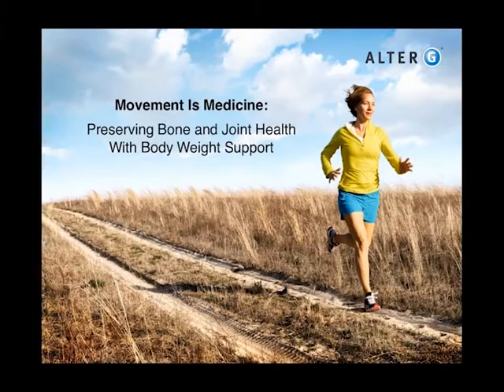And then I also focus more on the walking speed, maybe incline, before I change loading. So when someone's in the AlterG and I know that they're pain-free at 60% body weight, I will challenge them to try to take bigger steps. Again, because if they're getting better hip extension, then maybe they're stretching out those hip joints, hip muscles. So you're taking it through the full range of motion versus a smaller gait pattern, where you're just loading cartilage in a certain range. So the progression would be no more than 10% each week, and then make sure you work on speed and the kinematics before you work on loading.